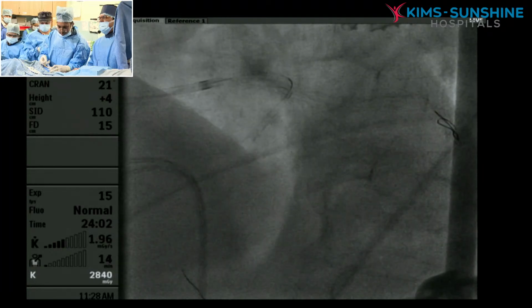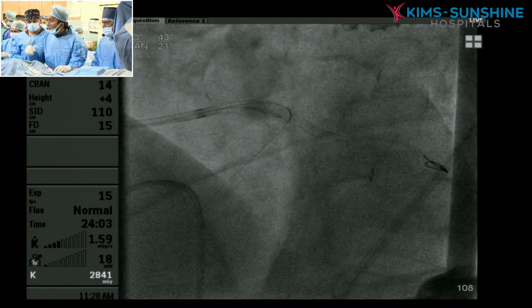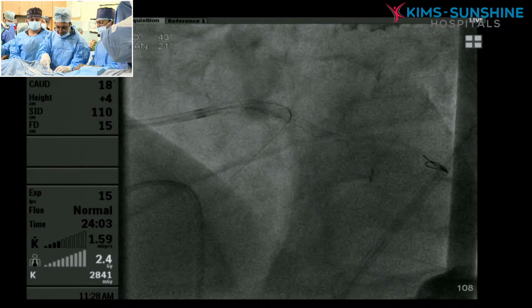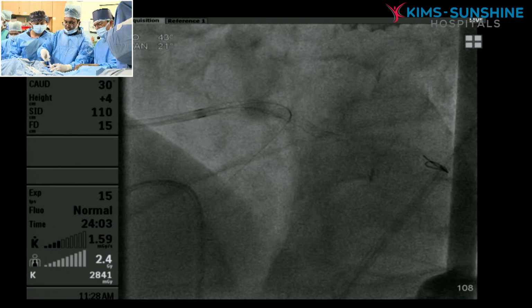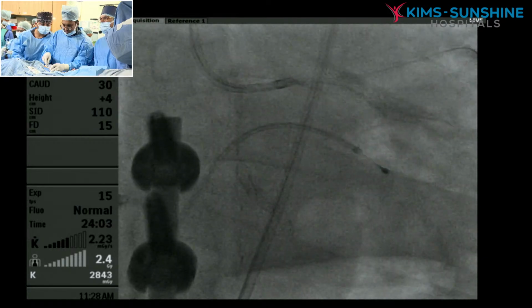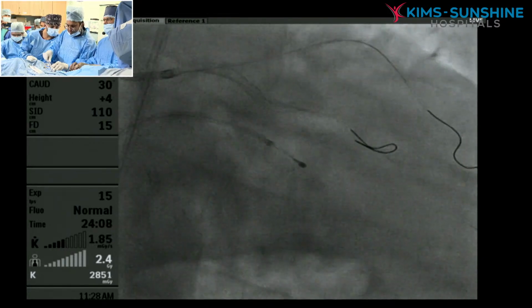If you are ready, let me know. Brother, come to first PA cranial. Let me see the L6 distal flow. If you want, I will open it. LM plus TVD. Pressure is fine, right? Pressure is fine. Right. Brother, PA cranial. Ready, brother?